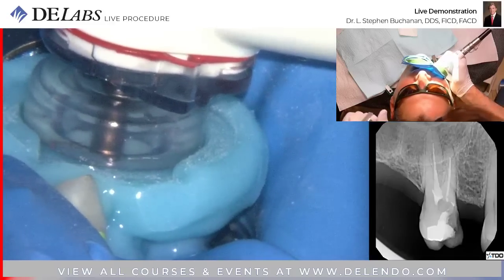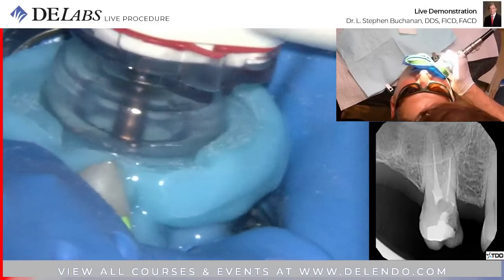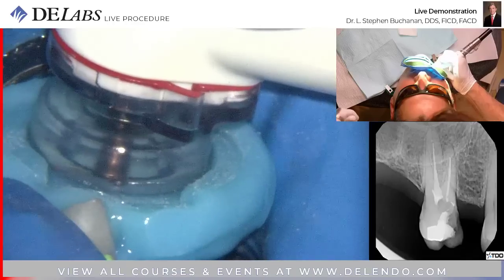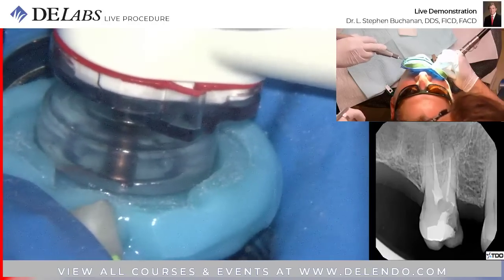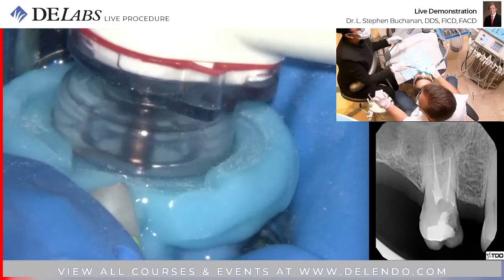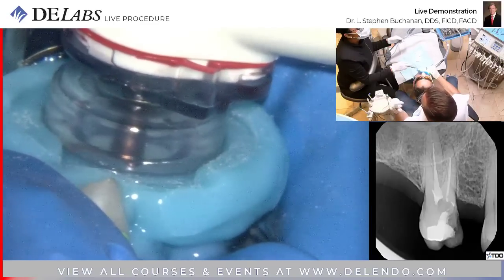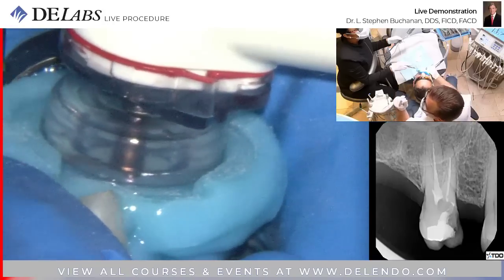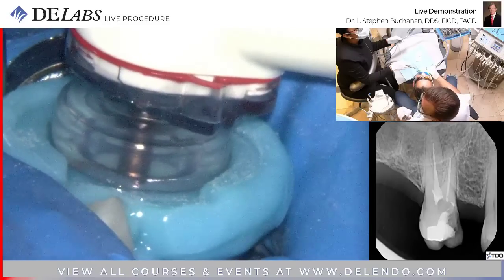So when you see this in a true tooth, it's pretty trippy. The way the sound energy works is it's echoing down the walls of the dentin. If we didn't have hard tissue dentin walls, it wouldn't work. And the way that it self-limits is when it gets to the end of the root canal, you have soft tissue there and the sound energy just dissipates. It's like being in a galleria where there's sibilant noise because of the tile and the marble and the glass and the plaster, you step off into a clothing store and it gets suddenly quiet. That's because it's absorbing the sound instead of reflecting it. That's what happens at the end of the root canal.